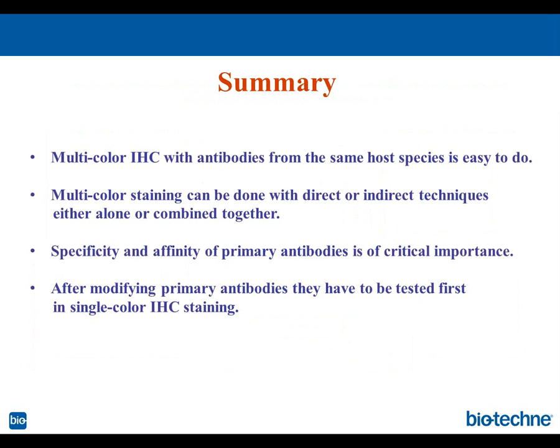You can add your primary antibodies to the cells. We use quite often the so-called chamber slides, where we pour antibodies right there, and then can remove the chamber at the end of the experiment. Yes, absolutely, it's applicable to any sample.